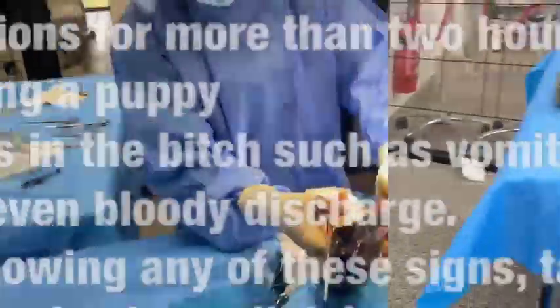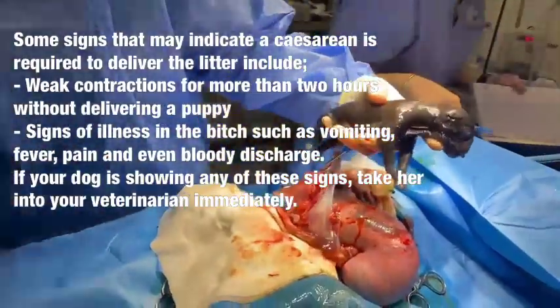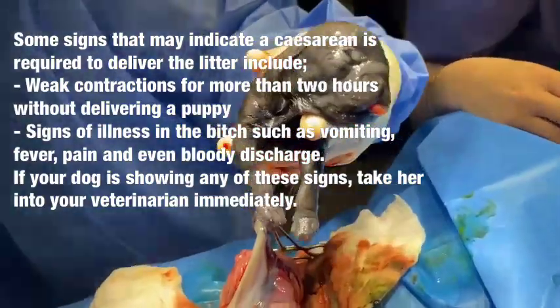This is our second puppy — quite a large one. This one's moving already, you can see it's raring to get out. We'll pass them off first.